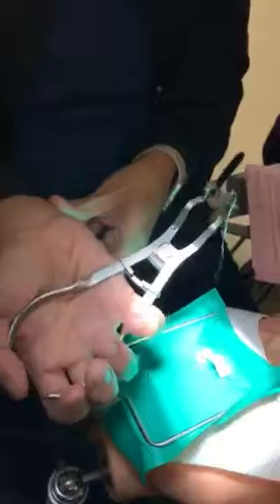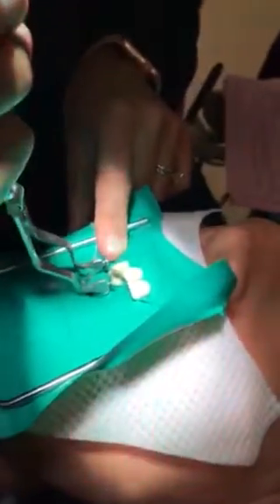I'm going to slide this on over the first premolar. When I do this, you'll see that it sits right in the palm of my hand so that I can hold it. And when I place it, I'm going to go down on the lingual side first and then pull it over the height of contour of the tooth onto the buccal. So you'll see I'm going to go on the lingual down to the gingiva and then over the buccal, place it down at the gingival margin, and when I do that, I can slide this little lever off and it comes right off.